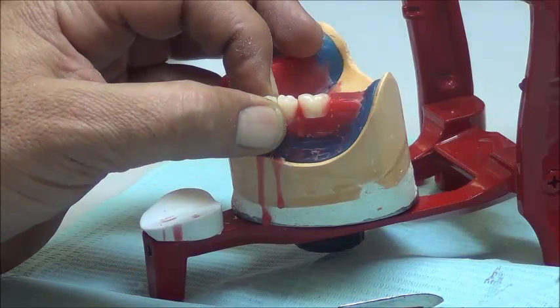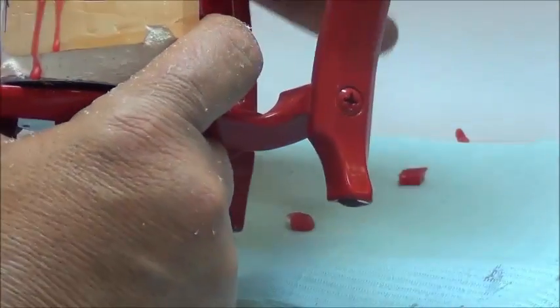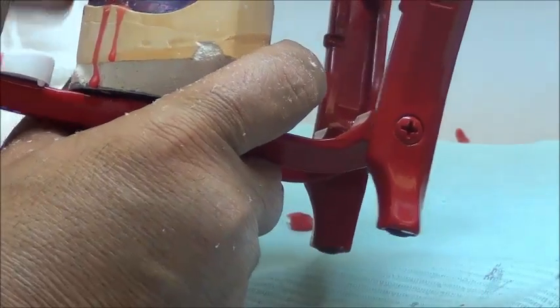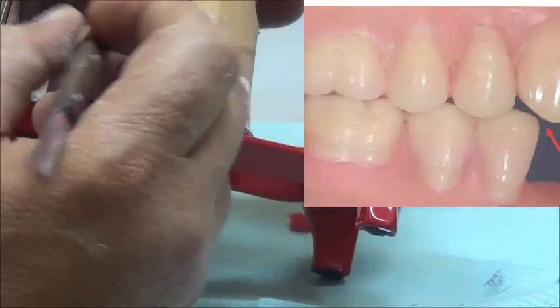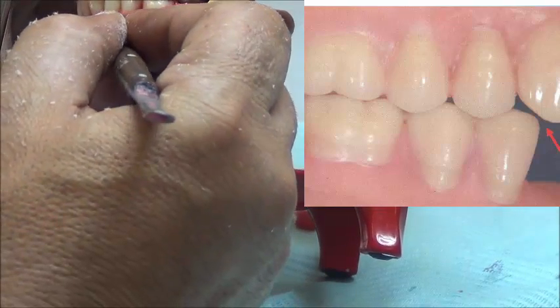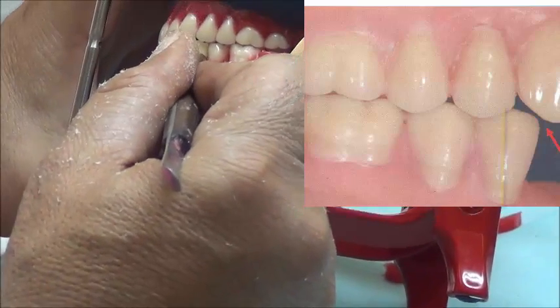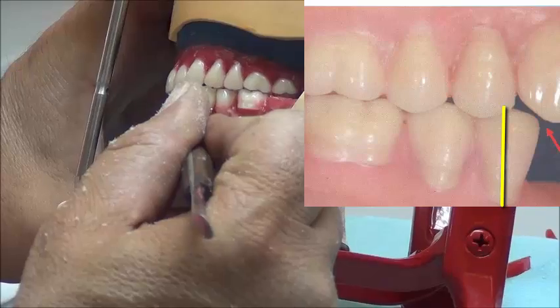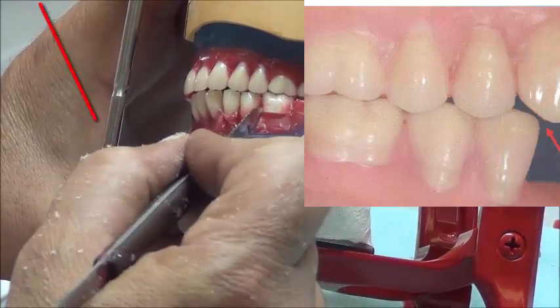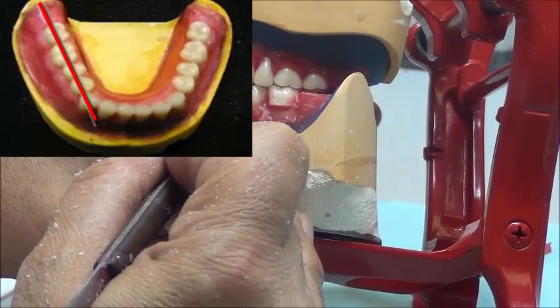How do you know it's fit in place? Once we close the articulator, we want to make sure that now it's fit with the upper without any space between the posterior teeth. So it went into place, and we are trying to just orient the roots of the premolars of the lower are also upright as they were in the upper. So, like at tooth number 6, there is no space. Tooth number 5 is in contact and with no space. So that makes sure that we have added the tooth in the correct position.